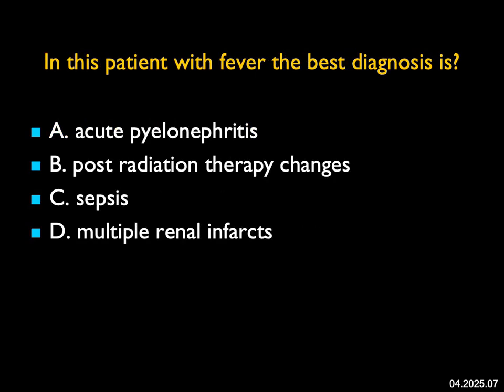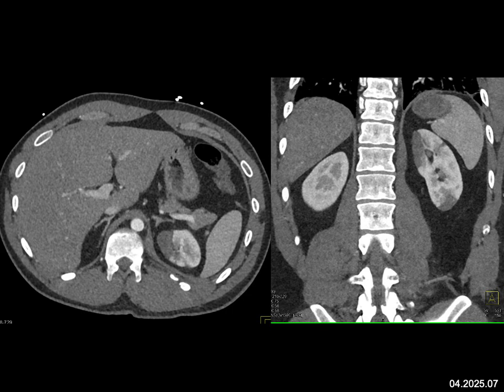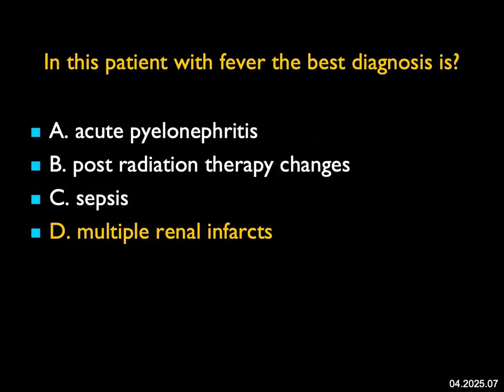In this patient with fever, the best diagnosis — the liver, spleen, and pancreas look okay. But in the left kidney, there are multiple wedge-shaped defects. The differential diagnosis is between infection and infarction. Infarcts or infection could be unilateral or bilateral. This is not radiation therapy changes because it does not match a port. Sepsis would be more likely with infection, but can occur with infarction. What pushes me toward infarcts — the lesions are sharply marginated and wedge-shaped. With pyelonephritis, you can see focal or diffuse involvement, but margins typically aren't so sharp. The best and correct diagnosis was multiple renal infarctions.